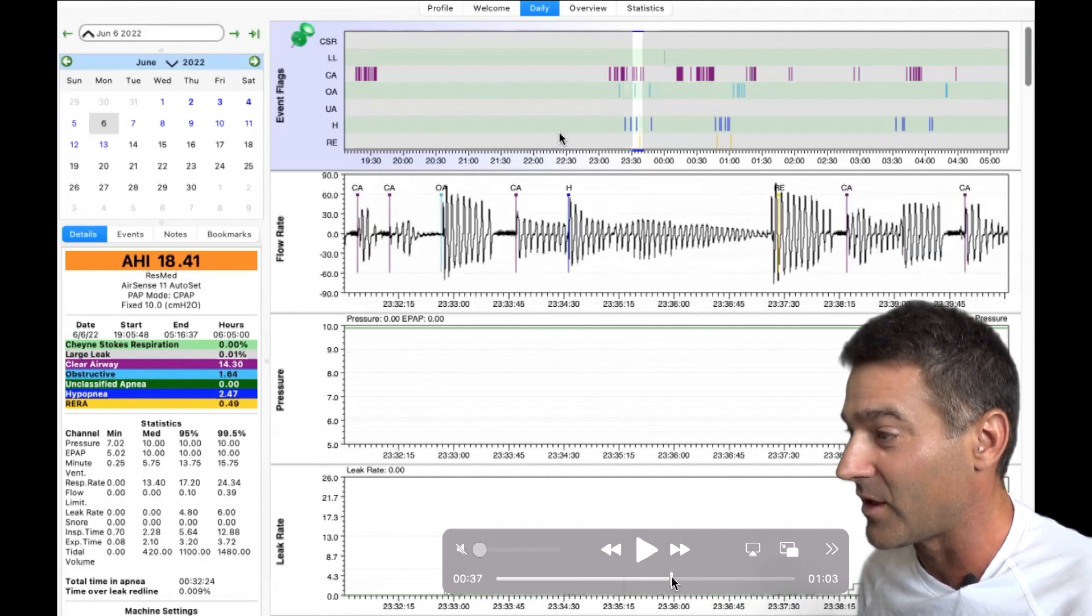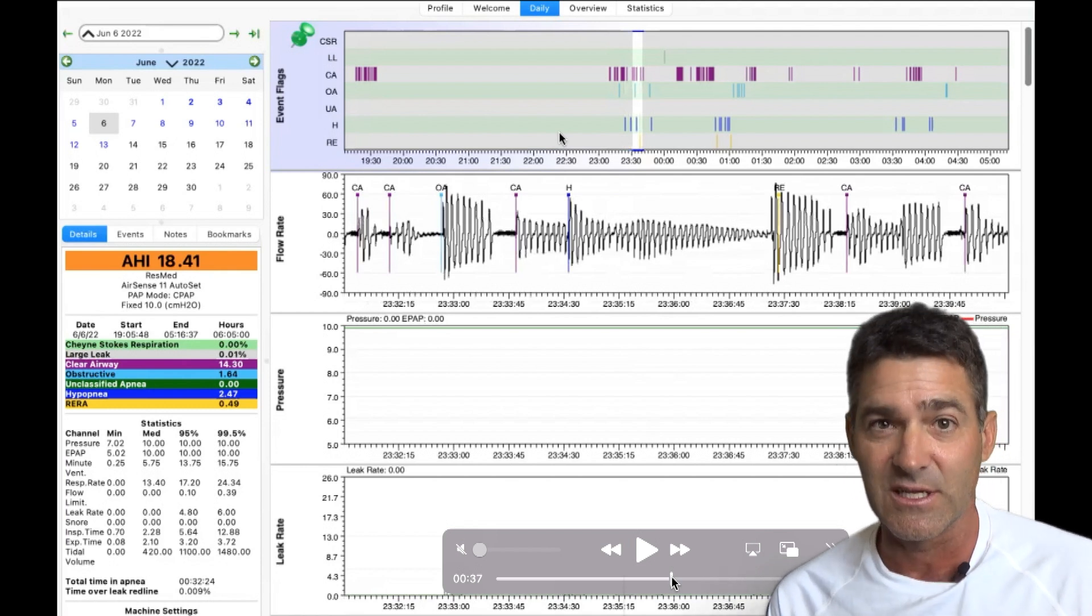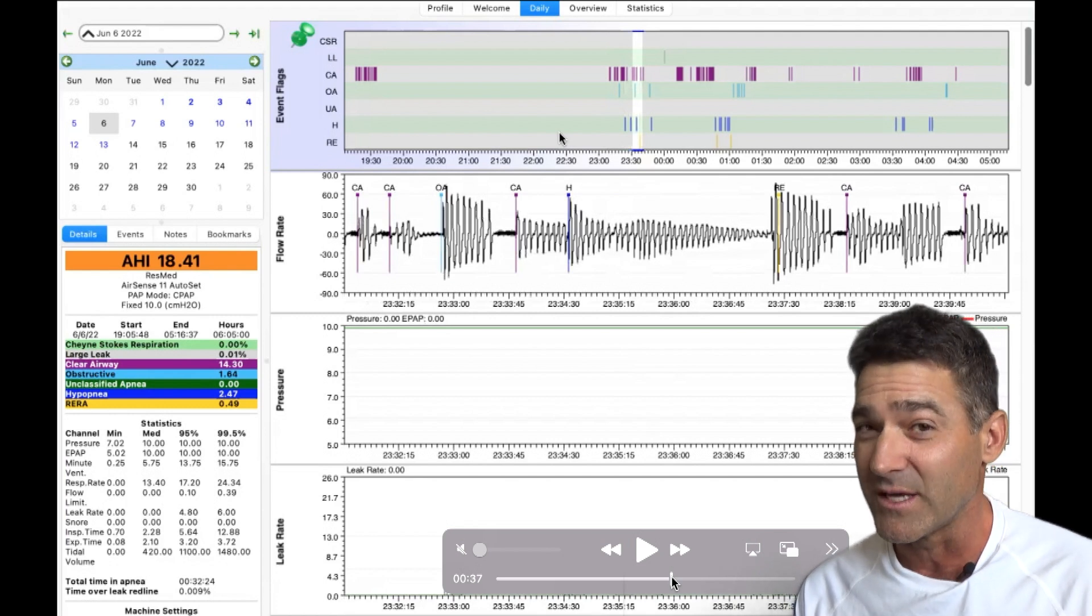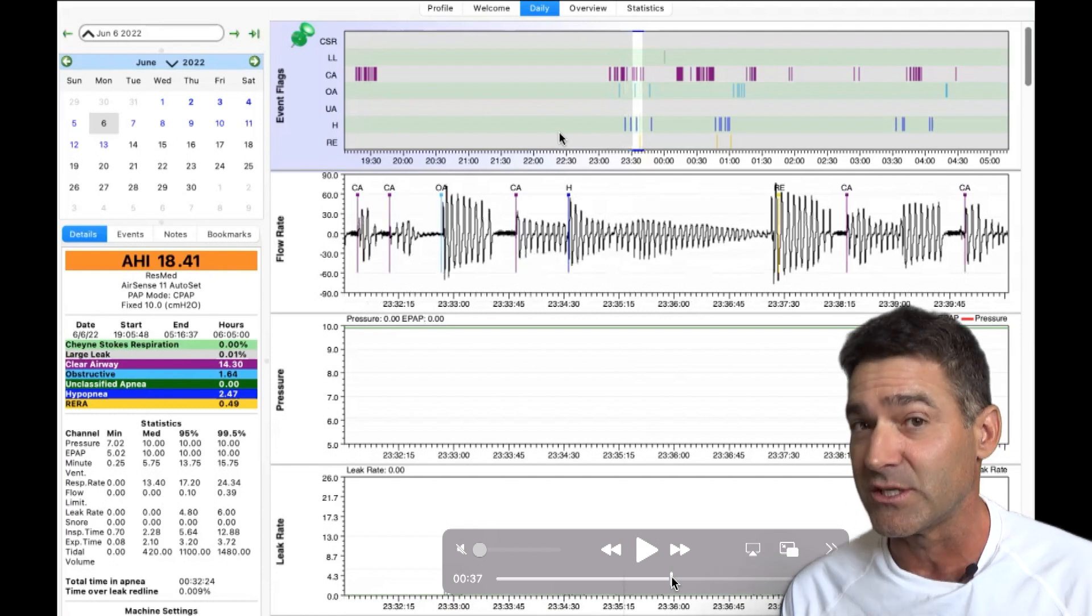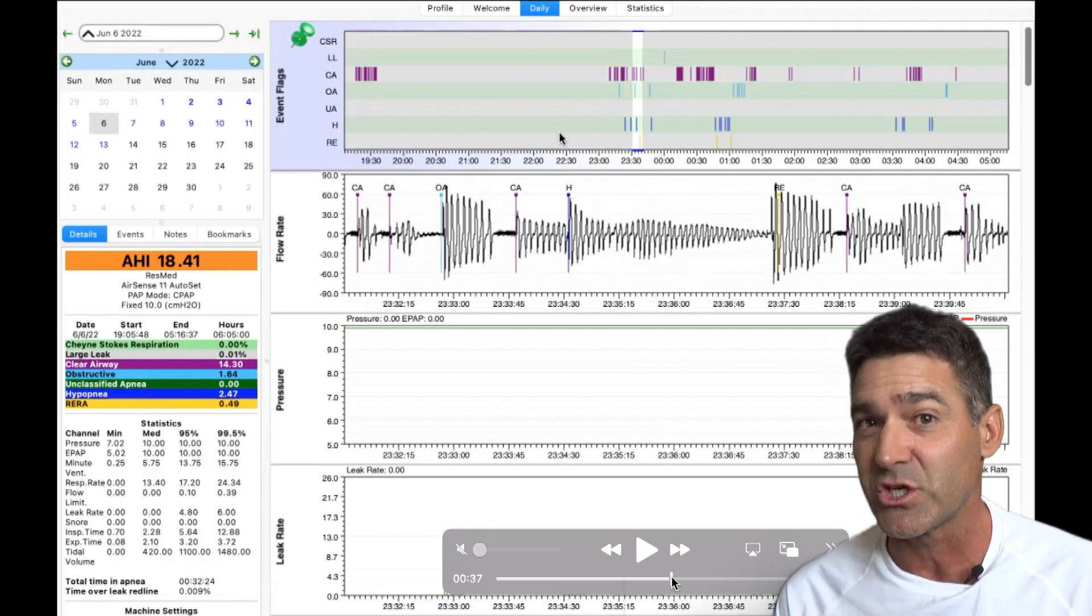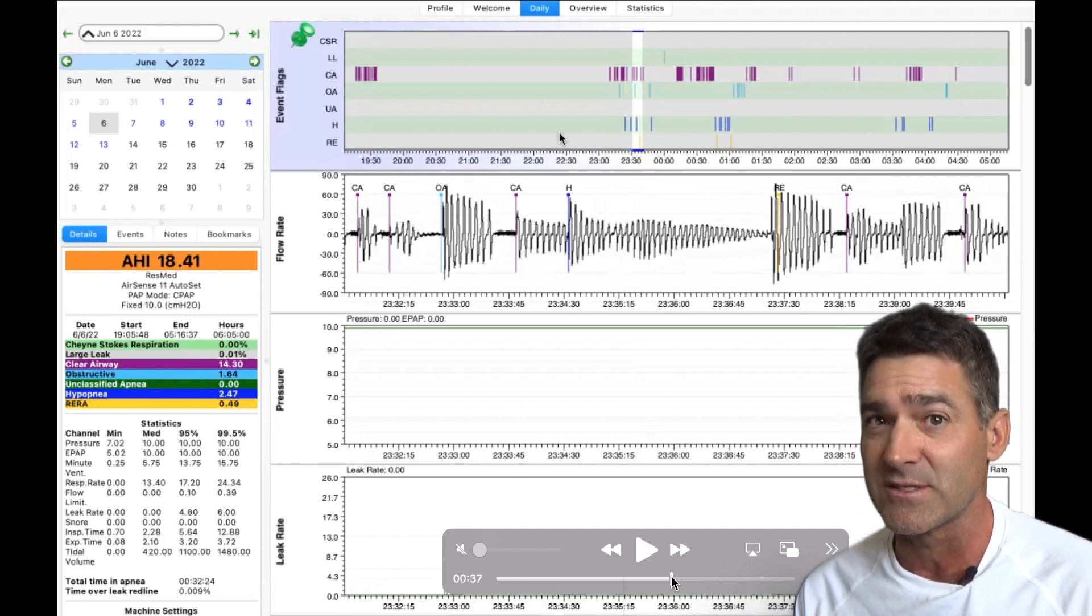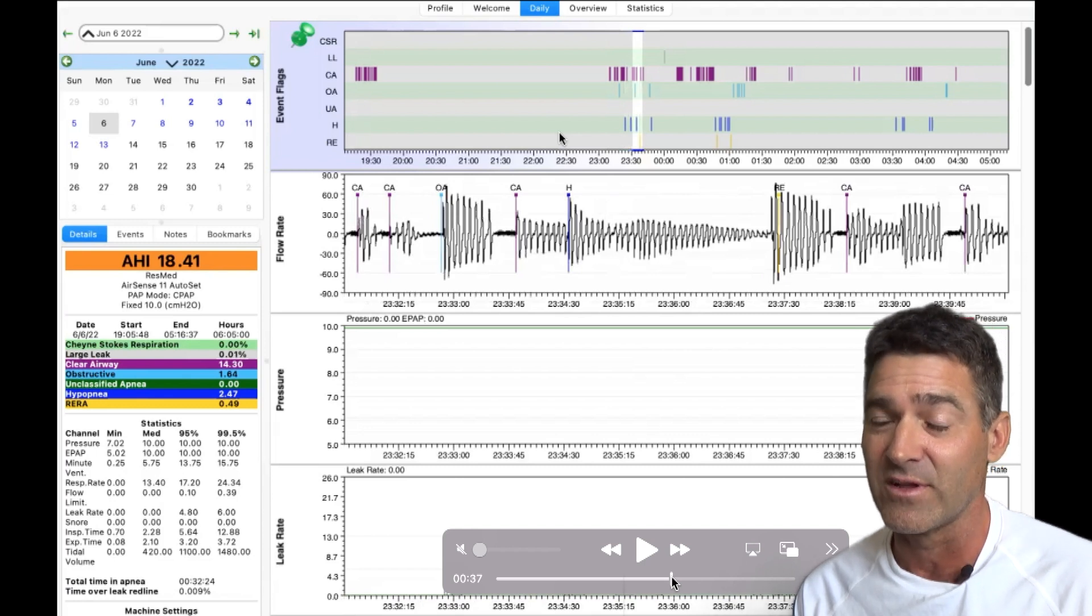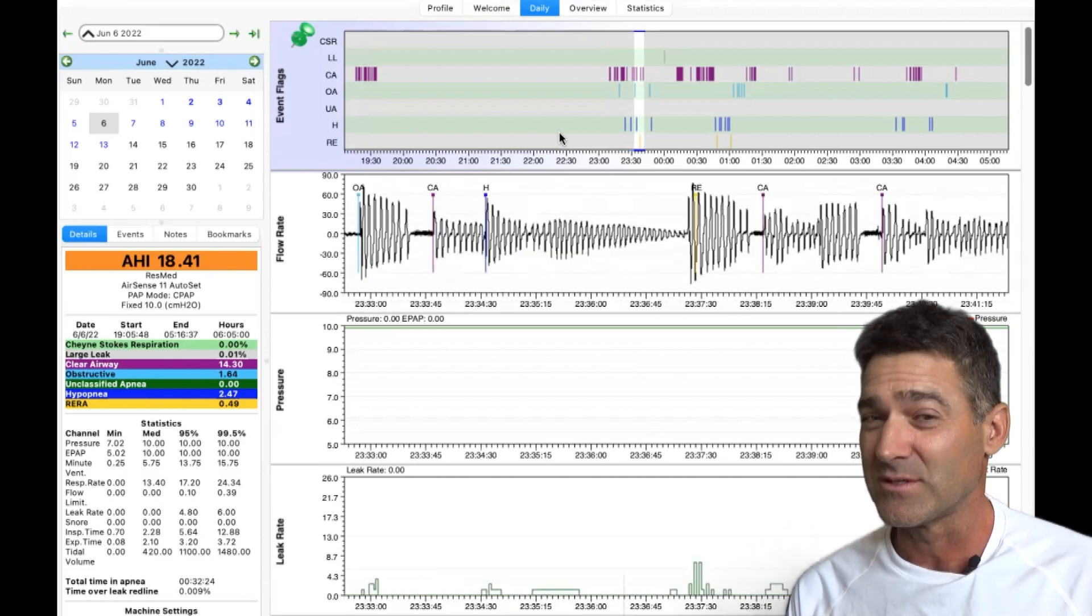He's at 10 centimeters of water here and he is having periodic breathing really all throughout. Some of the solutions to this, if he continues to live in Salt Lake City, is he's going to have to possibly use oxygen supplementation. Another thing that he could potentially do which would probably be better is switch to an ASV machine. But the first thing to do that we're trying is positional therapy, decreasing the pressure and see if his chemoreceptors are actually overly sensitive and if over a period of time they desensitize.